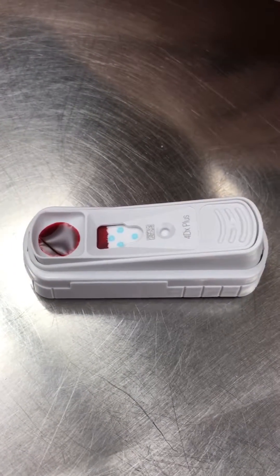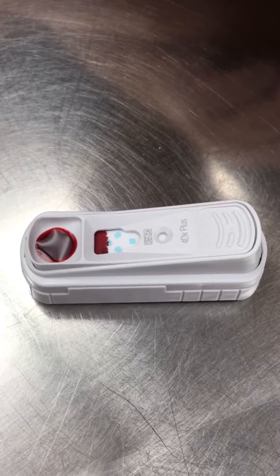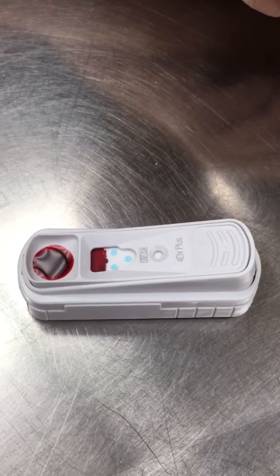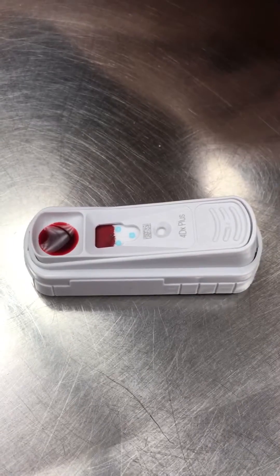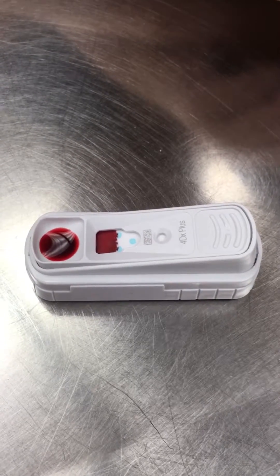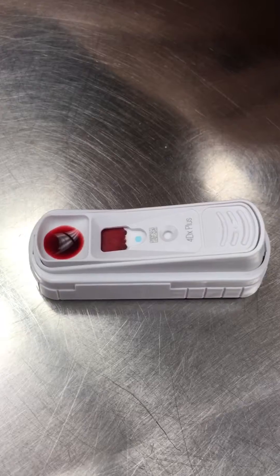Generally the SNAP test takes about 10 minutes to get a solid result — whether we are positive or negative for heartworms or Ehrlichia. Sometimes it can be really slow, so now we wait.